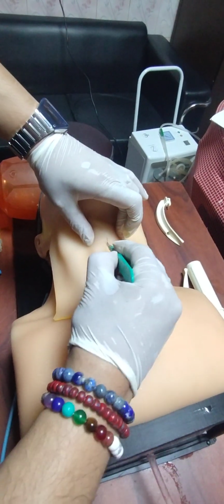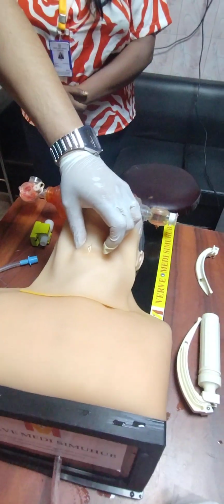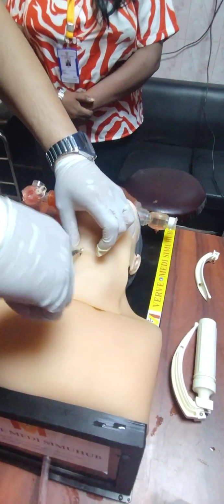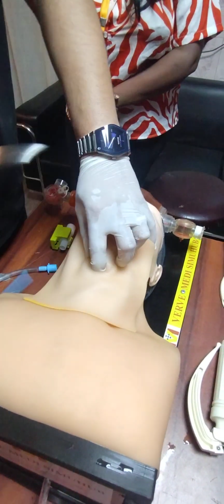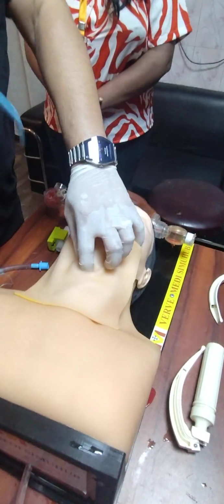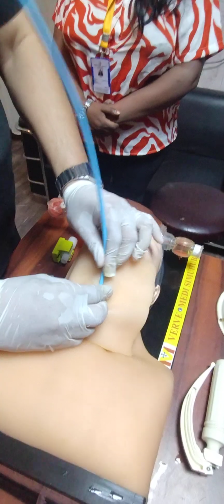One more step. Dilate it with a finger or a curve. Give me this. Put the bougie. This is the finger. So put the finger, put the bougie. Load the tracheostomy tube.